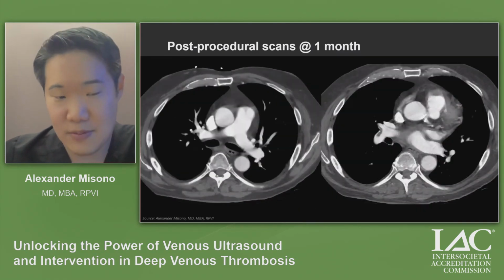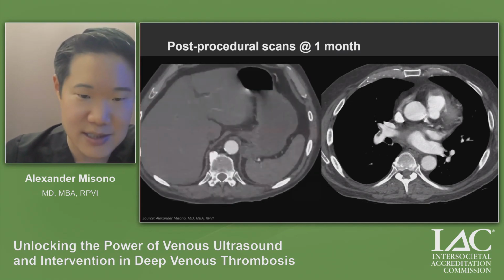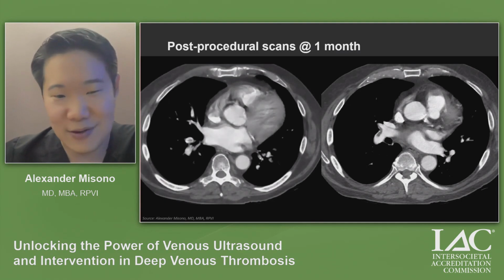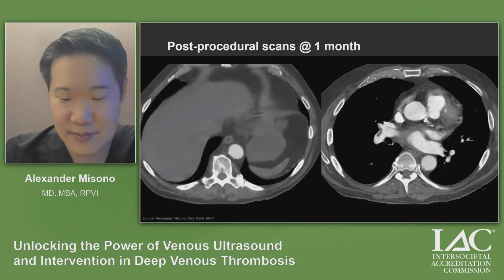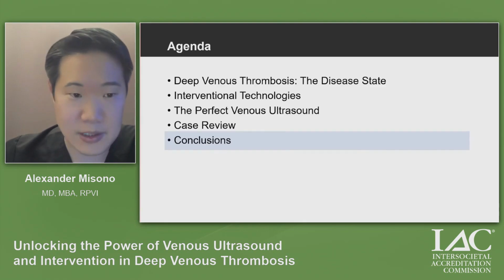We also took a look at the pulmonary arteries again, to prove to ourselves, particularly because of the chronicity of that thrombus material, that the lungs remain clear. We didn't throw anything up there, nothing embolized up there as well. So it brings me to my conclusions here.